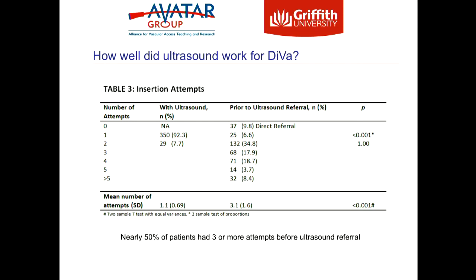And when we looked at the pain score out of 10, when the patients were asked what the pain level was like, it was 2 out of 10 or less with ultrasound, compared to 7 out of 10 or more without ultrasound. So clearly, the use of ultrasound in terms of pain on its own was quite successful. So again, right inserter, proper training and procedural load is important.